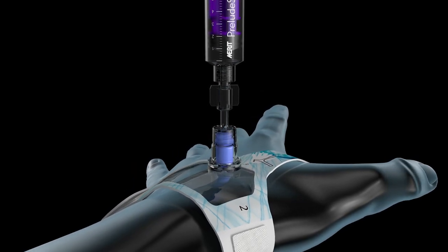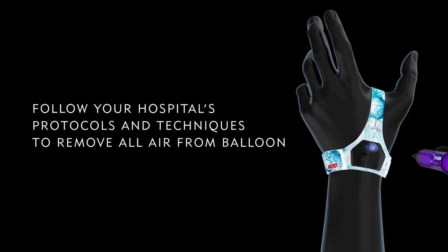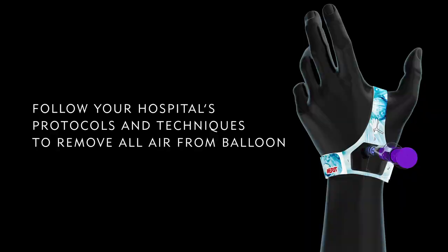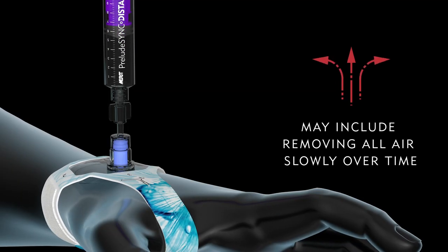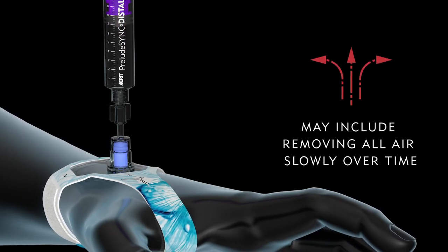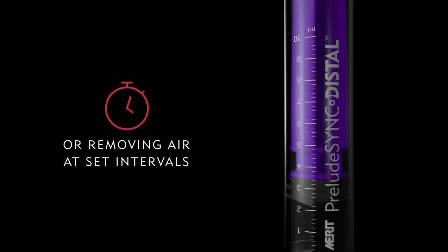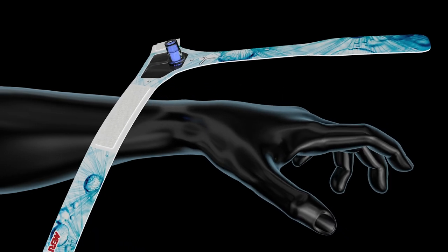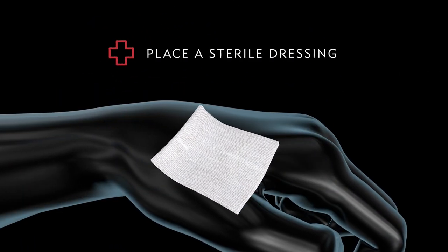When you're ready to remove the device, follow your hospital's preferred protocols and clinical techniques to remove all of the air from the balloon. This may include removing all of the air slowly over an appropriate period of time, or removing small amounts of air at set intervals. Finally, remove the device by carefully undoing the straps and place a sterile dressing.